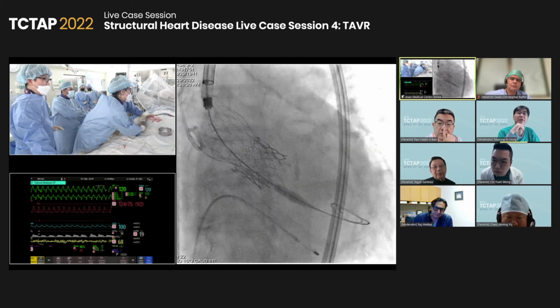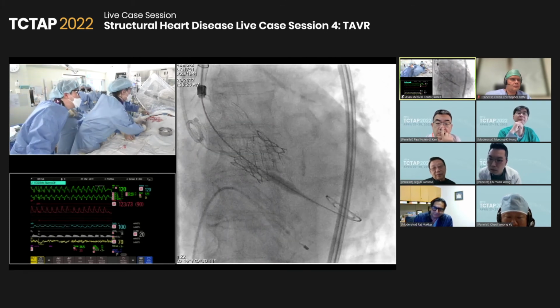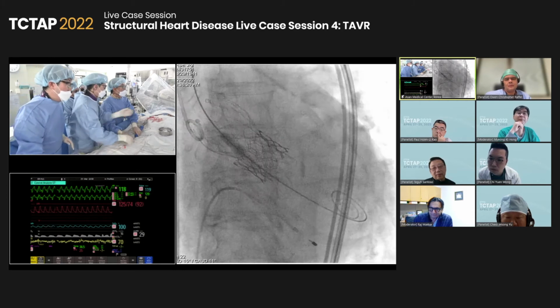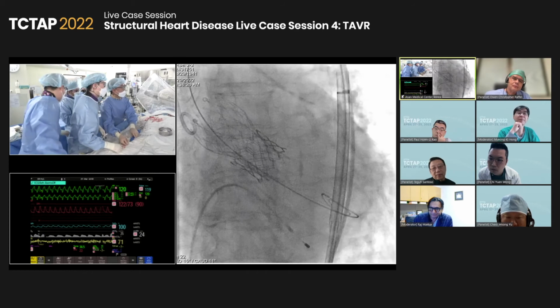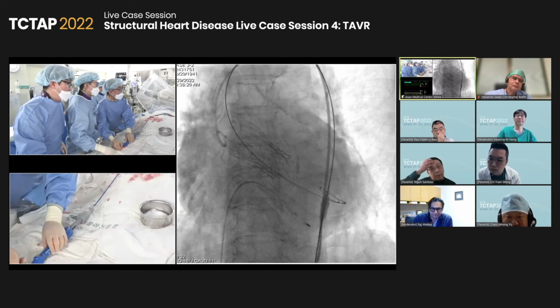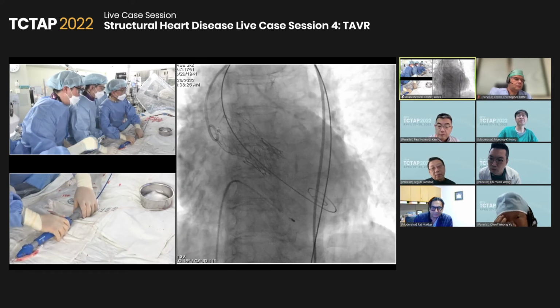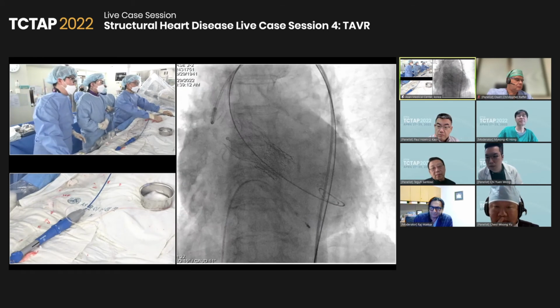Okay. Excellent. Okay, all done? Release a little more. Okay, got it. Slightly pull back over here. And then absolutely be careful. Yeah, nice position. Curve. Okay. Release a bit. Take a gray-scale shot from here, pull it, place it like this, and pull the gray. Press behind it. Okay, keeping the wire. Okay. Let's do a test here.